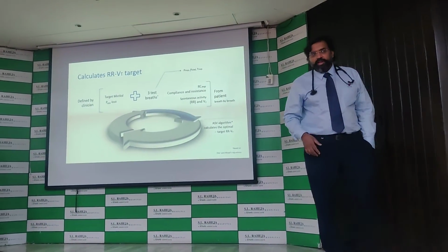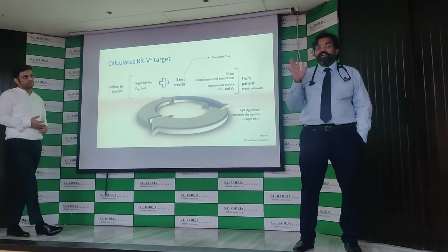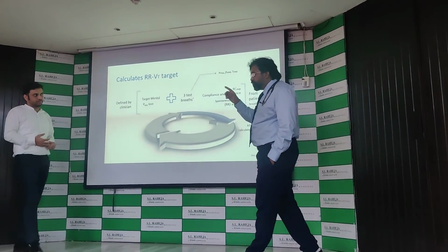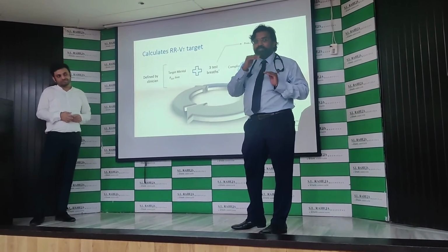No, we don't need to change that. We will never be changing that. In adaptive support ventilation, I am not changing anything. No, sir, you will change the minute ventilation. I will not change based on that graph. That graph is only telling me that the ventilator is doing its job. The ventilator does everything to get the plus into the box. I will not do anything.